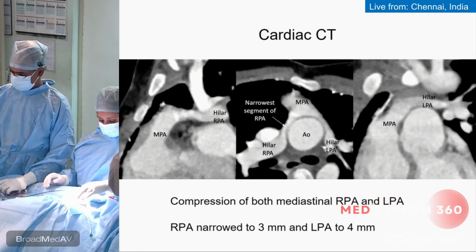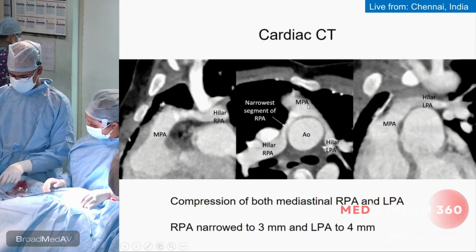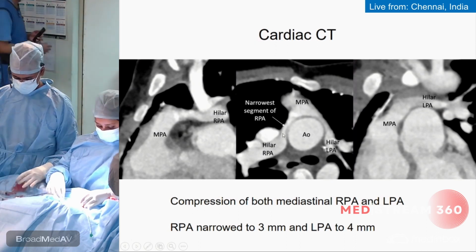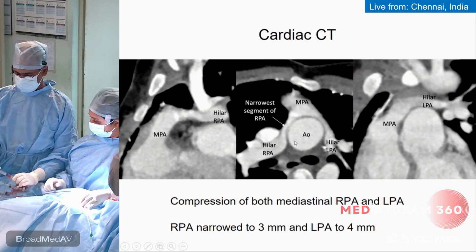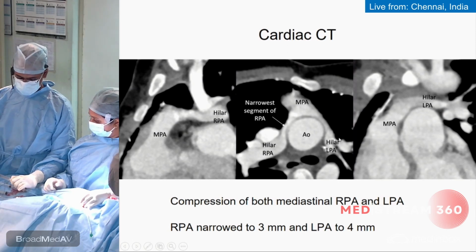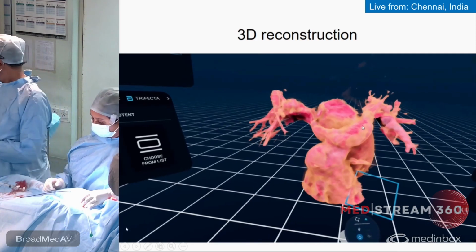So we did a CT. This is a CT which shows the Lecompte. This is the anterior MPA. This is the posterior aorta. This is the RPA and this is the LPA. We can see that the RPA has significant narrowing at the point of contact with the aorta, and the LPA also has significant narrowing here. The hilar RPA is good sized and the hilar LPA is marginally smaller. However, the narrowing was quite significant, with RPA narrowing around 3 and LPA around 4 millimeters.